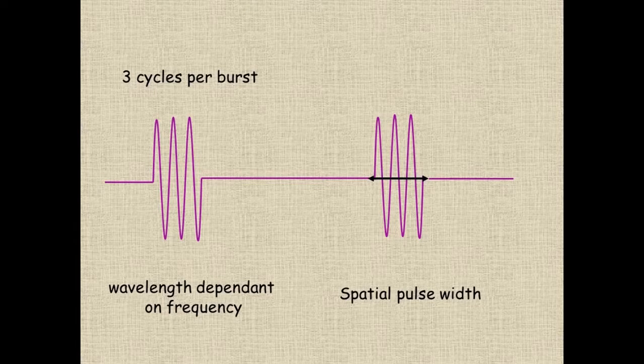Ultrasound waves are generated not as continuous bursts of energy but as cycles of energy, typically in very short bursts, around 3 cycles per burst. So there'll be 3 or 4 wavelengths sent out. There'll be a big delay before a similar packet is repeated. During the delay, that gives enough time for the sound to enter the tissues and be reflected back, which means that with each burst of energy, the ultrasound machine then listens to see what's coming back.